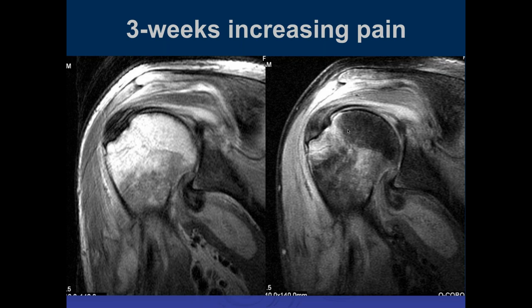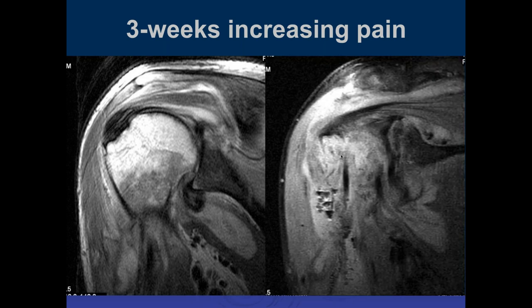Okay. Well, how would myositis be associated with bone marrow edema? Yeah, that would be like a component of osteomyelitis if it was infectious. It would be more infectious then, right? So here's some other images. So there's some susceptibility artifact.